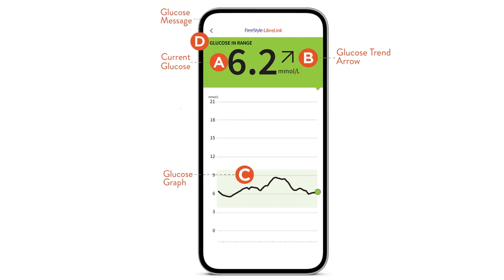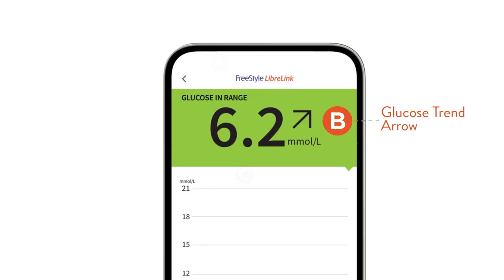Let's have a closer look at the trend arrow. The trend arrow shows you where your glucose levels are heading: rising, rising quickly, falling quickly, and changing slowly.